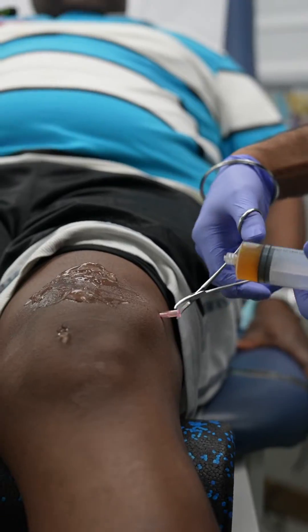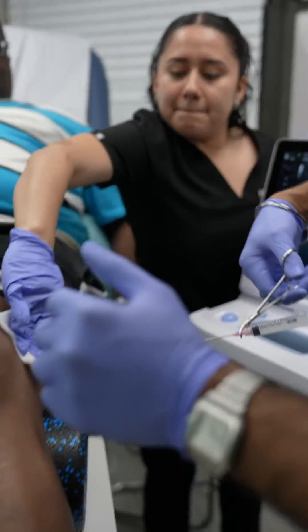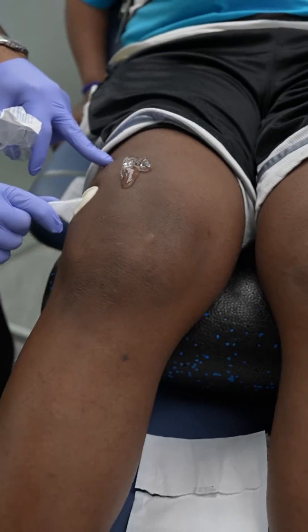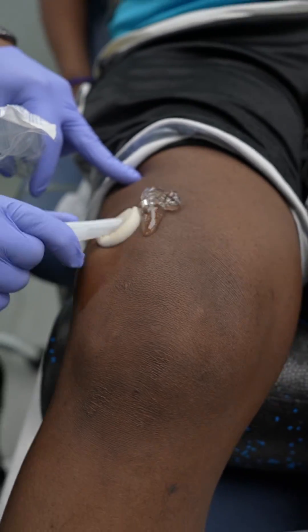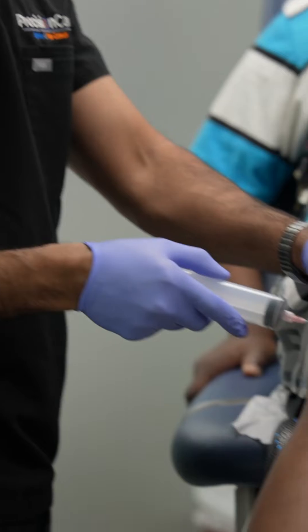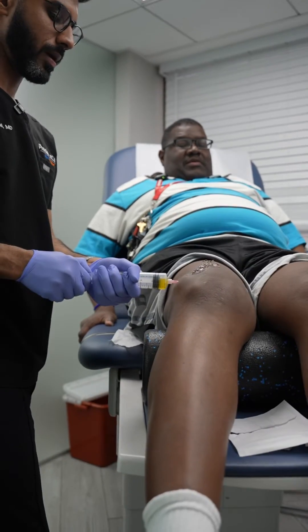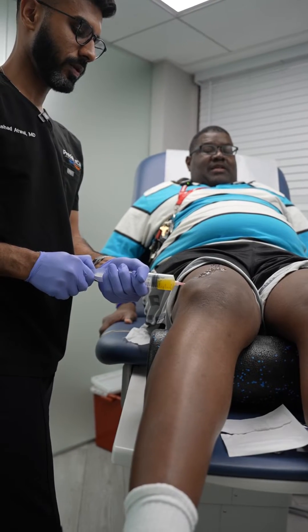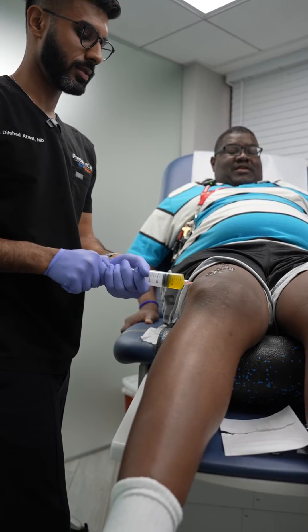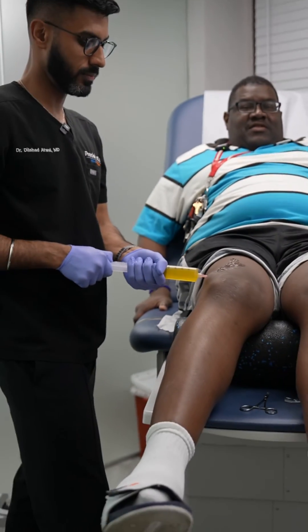Yeah, the pressure — you're good, you're doing great. So this is the medication going right in, that's it. Y'all I can't believe I'm seeing this — unbelievable, this doctor is real good. That's the fluid right there, same thing here, all of that is fluid. A little pinch, that's it. The shiny is the needle, the black is the fluid. How much you guessing? You guessed the correct amount — you got a hundred dollars!